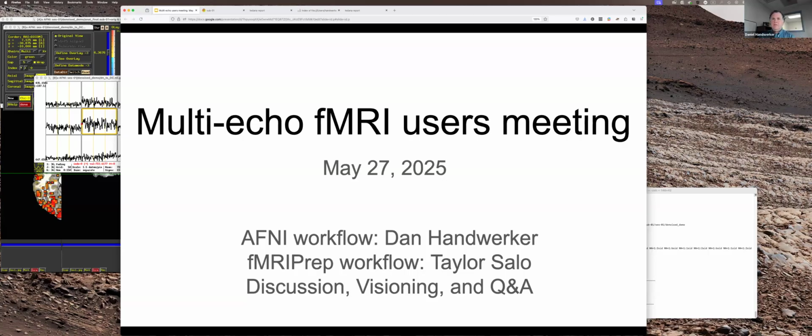Okay, excellent. This is the second time we've done this type of meeting. The first meeting was pretty structured, with three talks and a little bit of time at the end for questions. This one is hopefully going to be a bit of a flip, where myself and Taylor are going to give walkthroughs of pipelines of using tedana with AFNI and then fMRIPrep. Then we'll hopefully have a larger time for questions and discussion at the end, and maybe more time for thinking about this community and going forward as well. And we will see how it goes.